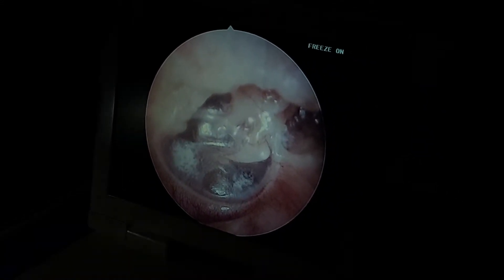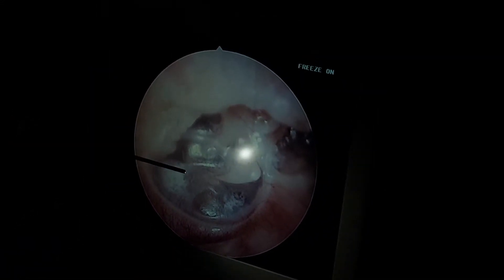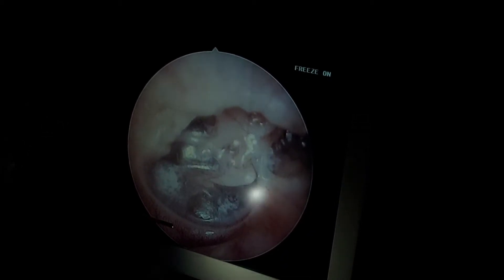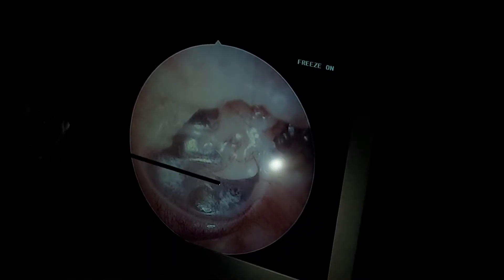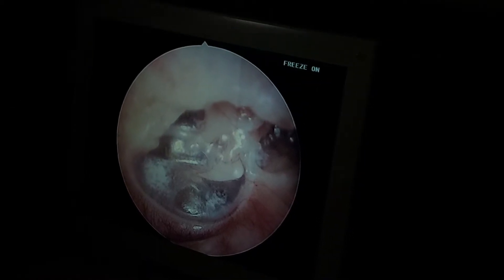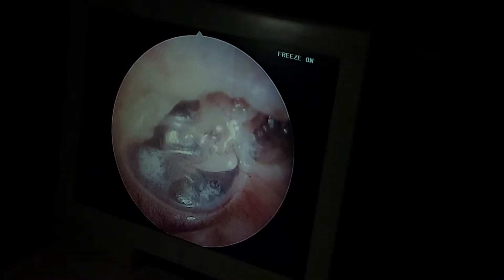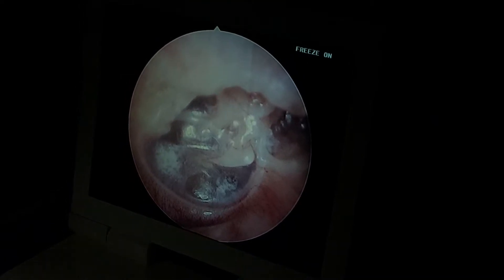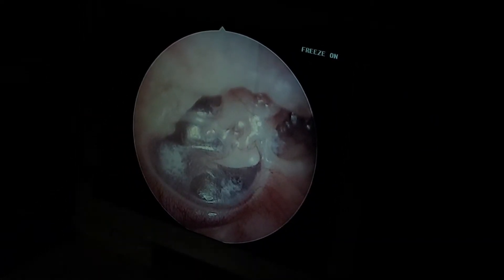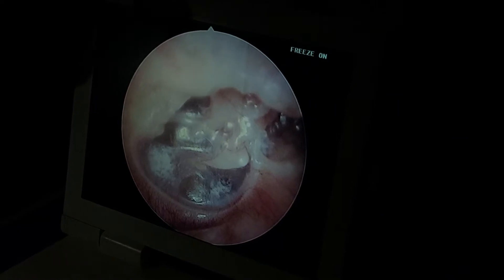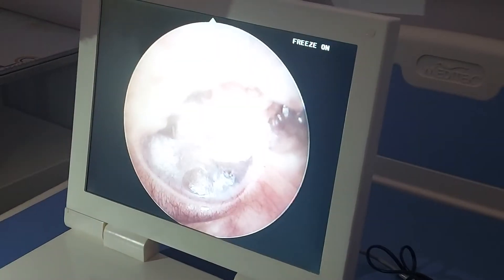It's a shortened handle of malleus. It's a prominent lateral process. The annulus is very prominent. If you press a pliable thing, the edges are prominent. Similar way, the annulus is getting prominent. This is one of the findings with which we can say that it is retracted.